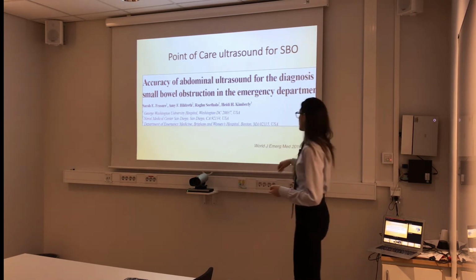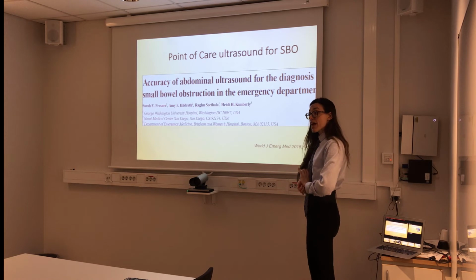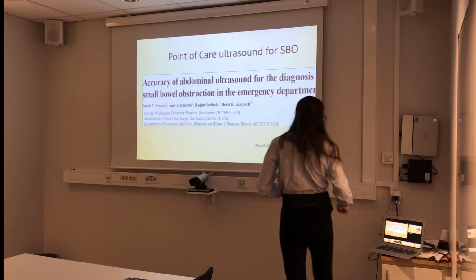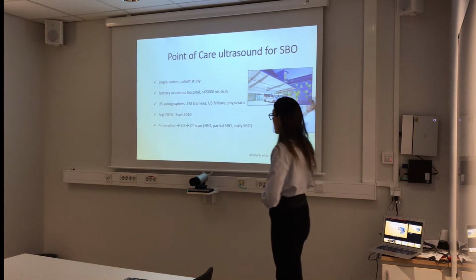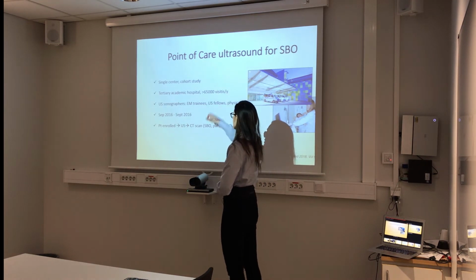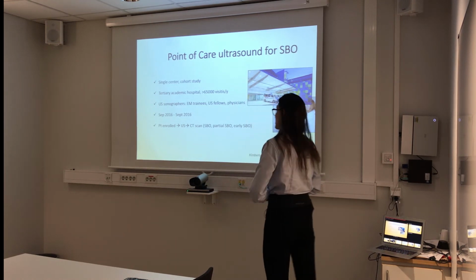This is another study, still from the World Journal of Emergency Medicine this year, on the accuracy of abdominal ultrasound for SBO. It is a single-center study in a tertiary care trauma center. Basically, they gave 3 hours of teaching to EM trainees, point of care ultrasound fellows and physicians, everybody. So how does point of care ultrasound perform for the SBO diagnosis?